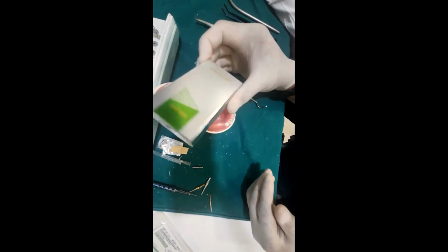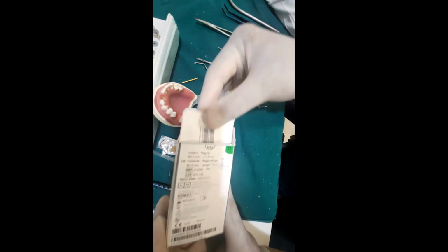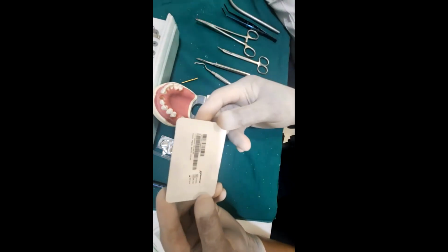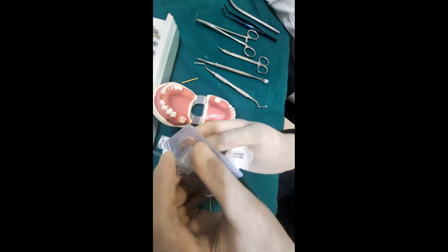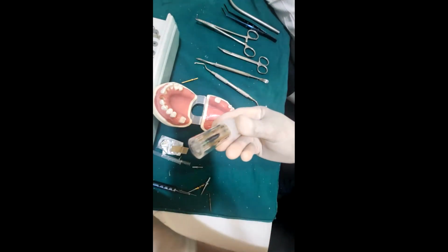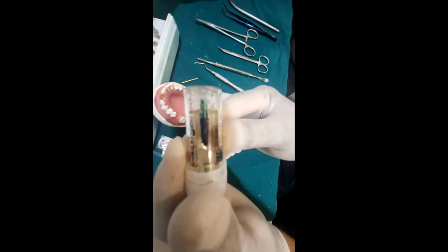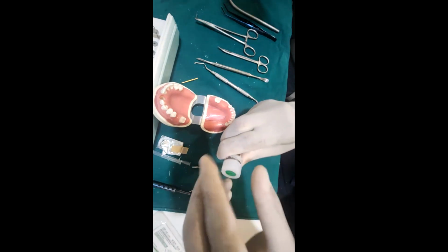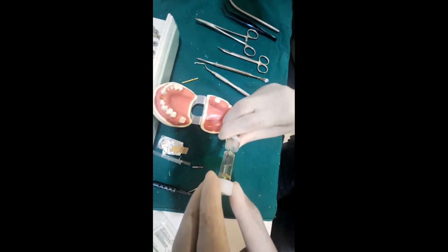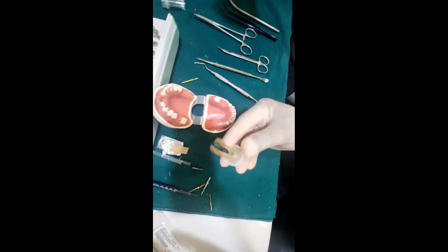So this is how your BV system implant is delivered to you. You open the packing, you have a sterile blister pack, you tear that, and you have the vial which contains the implant, and you open the seal carefully, and there's your implant with the implant carrier.